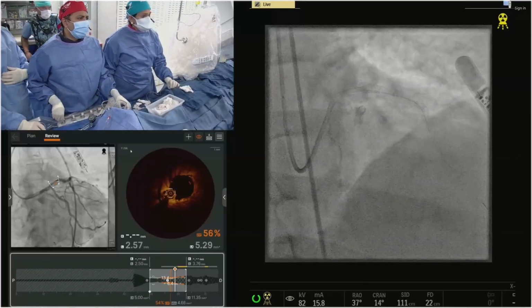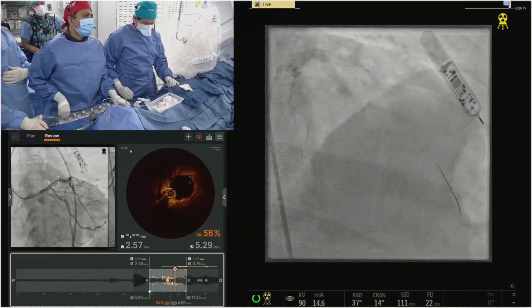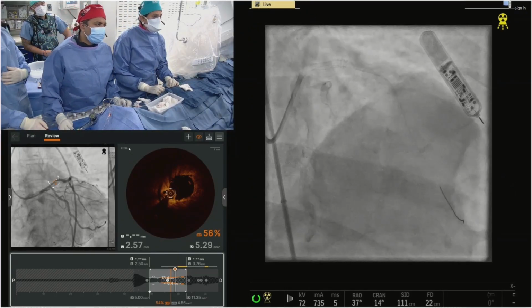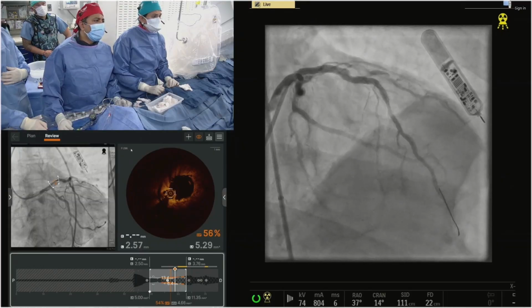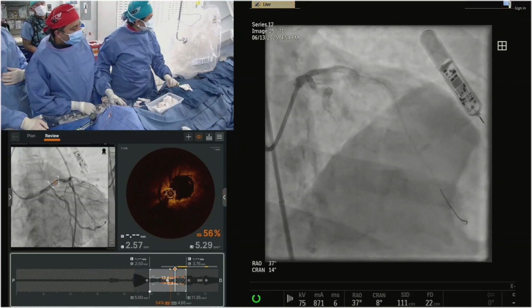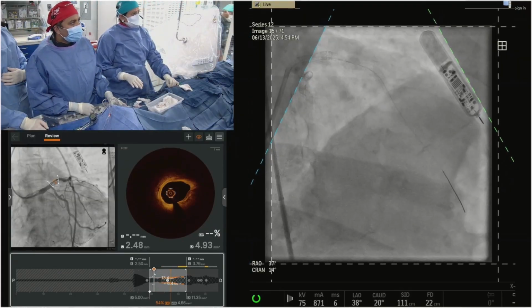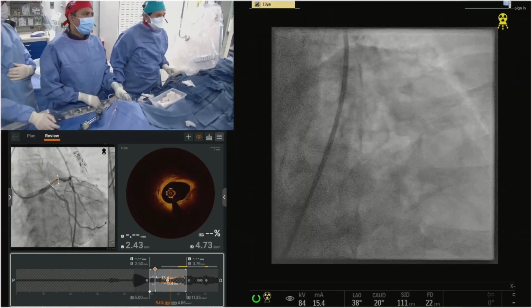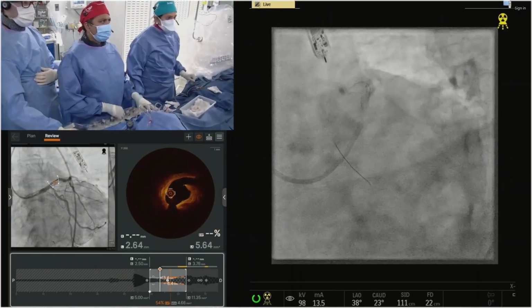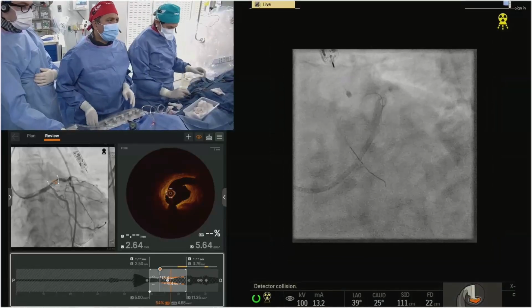Yeah. I'd get a different view there. So this one, and then I will take another, just for the fellows. Yeah, you have to be careful post-dilating something like this, that you don't start to expand it proximally and go caudal. Also take multiple views. I know we can image and confirm everything, but this is the view that's going to tell us anything. Ready?